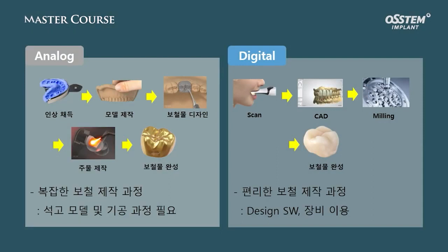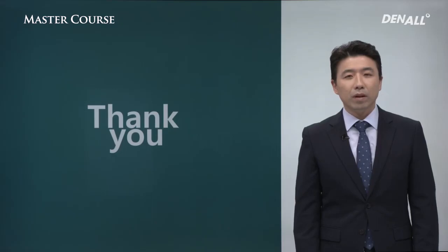There are many advantages. So digital impression taking has a lot of advantages. On the other hand, in an analog approach, impressions and models need to be sent and received physically, which is inconvenient. That is highlighting the advantage of the digital.